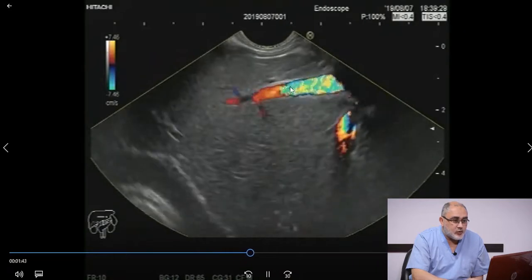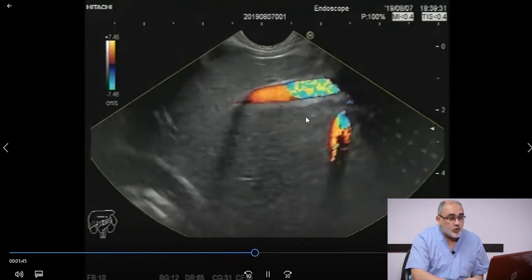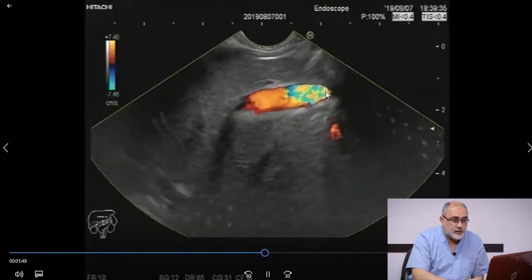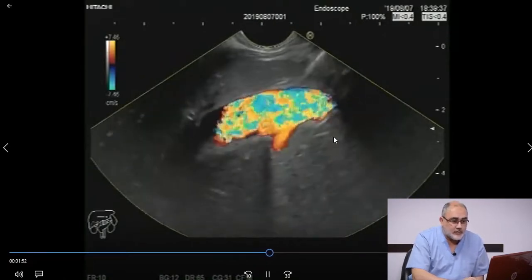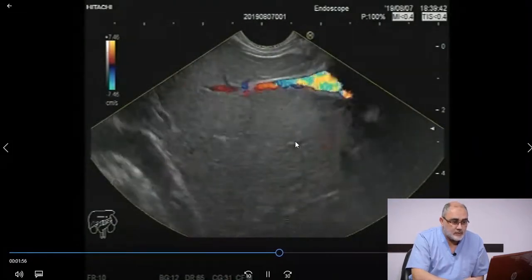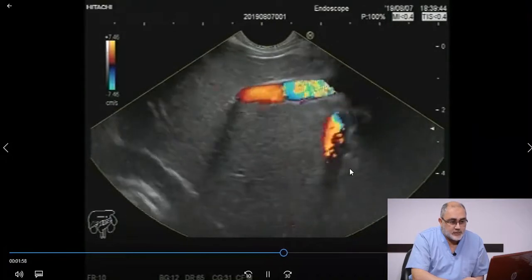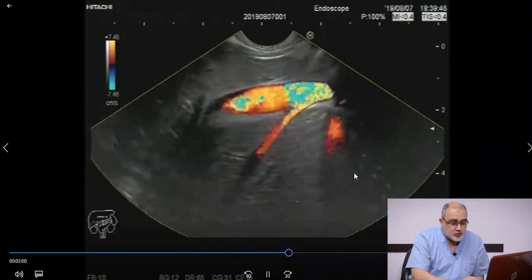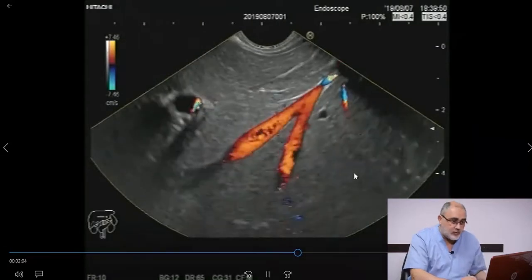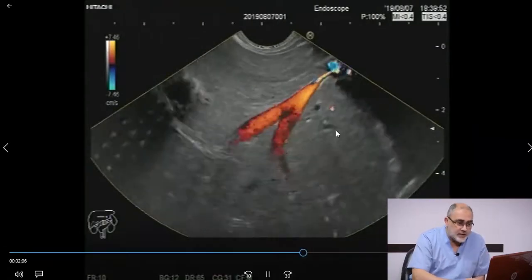And more clockwise in the opposite direction, clockwise to go back again to the inferior vena cava and the right hepatic vein. And segment 1, 8, and part of segment 7. So by counterclockwise and clockwise, we can go from the different hepatic veins.